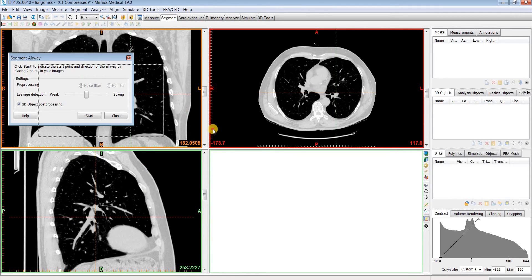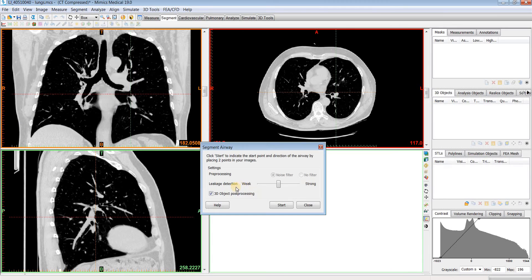Before starting, you'll want to choose your leakage detection. Leakages occur in regions where the contrast between the airway and the airway wall decreases, which causes the segmentation to leak into the pulmonary parenchyma, and subsequently lung tissue can get erroneously marked as airway. We have a slider to help control this behavior.